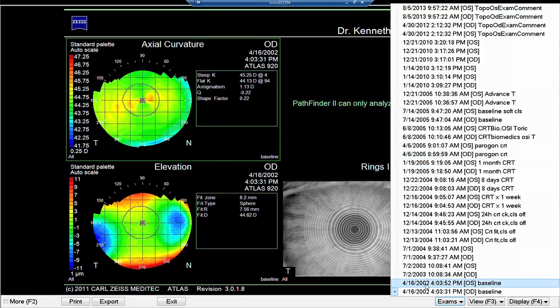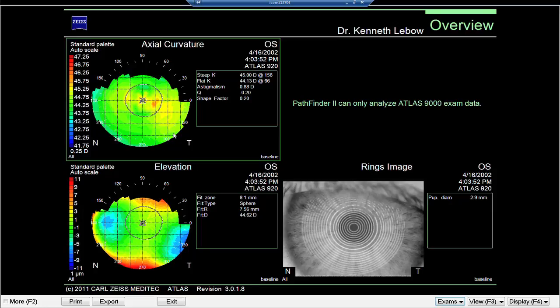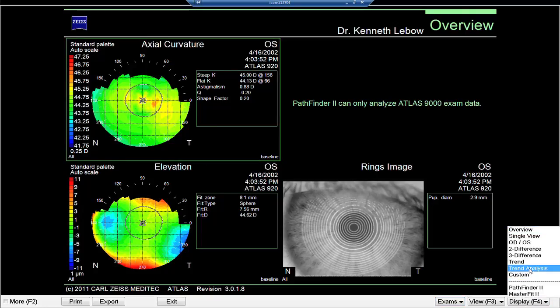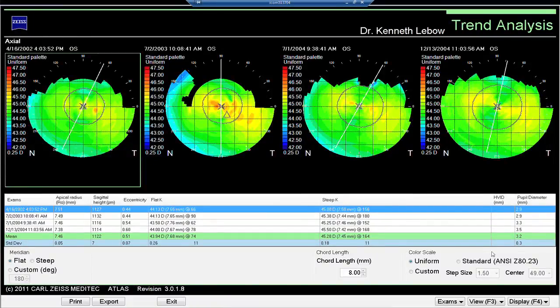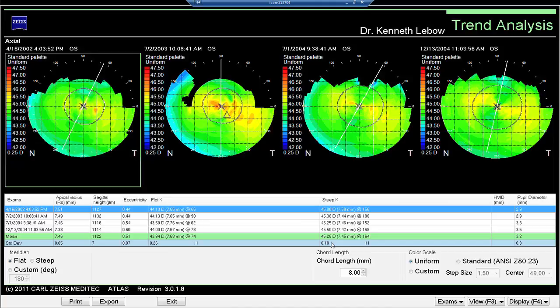Here again is the left eye with the oblique astigmatism — everything is perfectly normal. Looking at the trend analysis from 2002, 2003, 2004, and twice in 2004, when I look at the flat K mean it's 44 diopters with a standard deviation of a quarter of a diopter. So over a period of two years, Beth has had but a quarter diopter change in her flat K, and her steep K has had less than a quarter diopter change. That tells me the contact lenses are not inducing any type of corneal distortion to her eye — a very valuable piece of information.